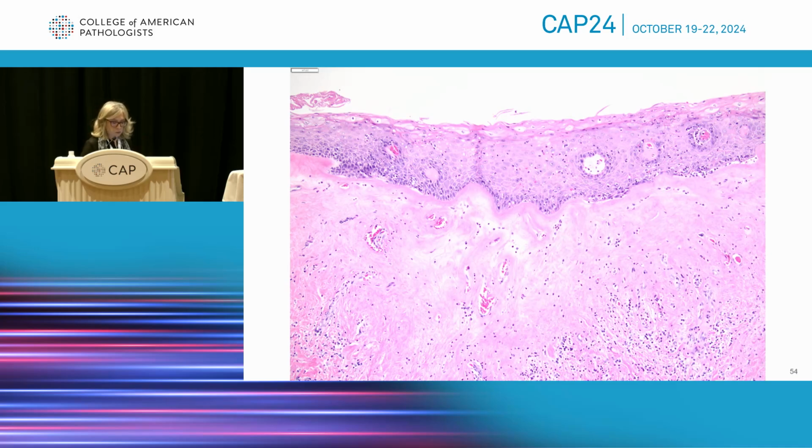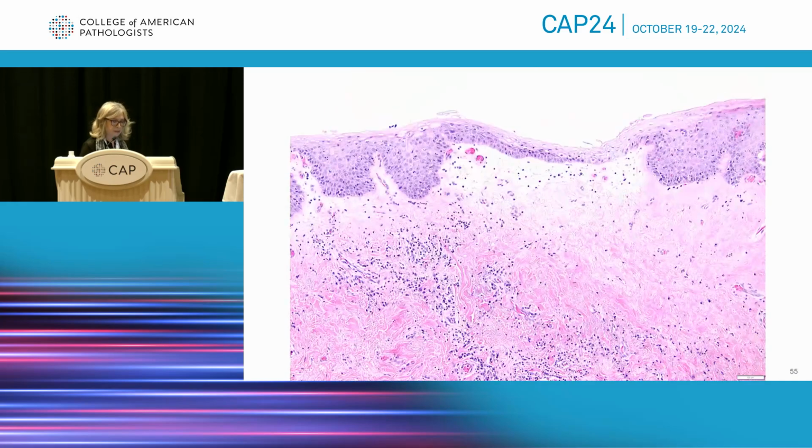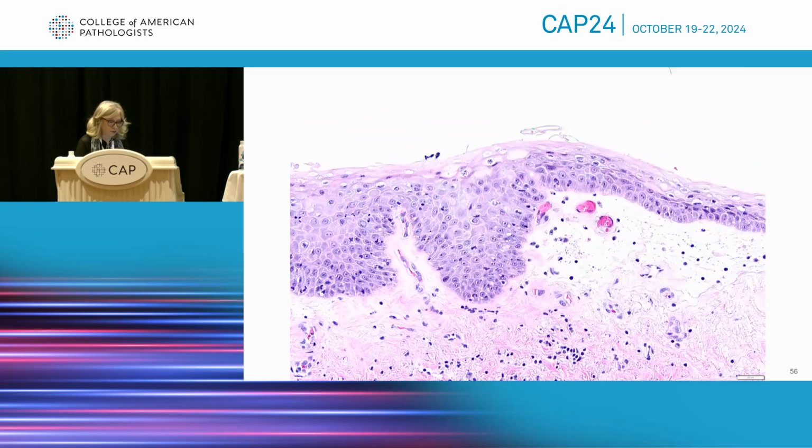And you can see there is homogenization of the very superficial collagen plate there. And then in areas, however, there was some atypia of the basal layer, and I'm going to get closer to that. As you can see here, there is also mitotic activity. So at this point, I was also kind of worried, was this real atypia? Or I see there was an edematous area nearby, but there was no clear-cut ulceration.